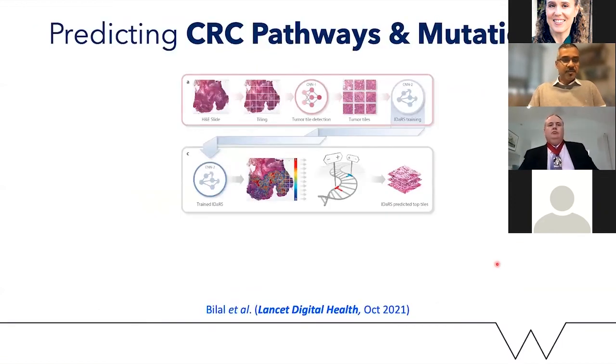And in our recent work in this space, we have shown that actually you can increase the performance of prediction of not only MSI, but other colorectal cancer pathways and important mutations in colorectal cancer. This was recently published in Lancet Digital Health.